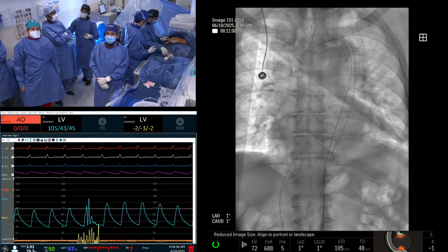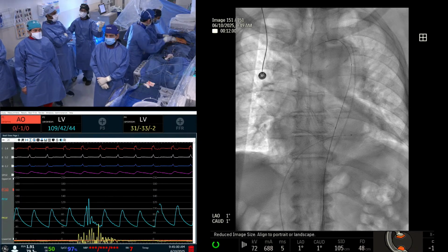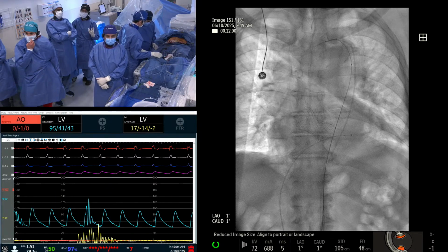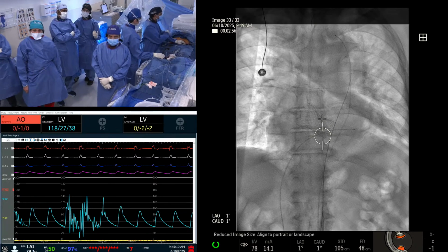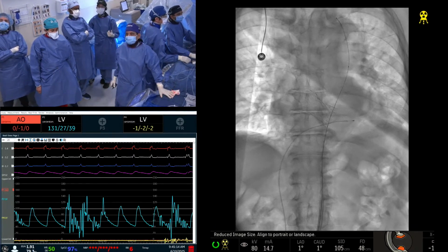If it's pure prosthetic AR or AS, like let's say this valve 5 years from now, 10 years from now, had failure because of stenosis or regurgitation, we would do in vivo sizing by CT. And we'll more likely use the 23 plus volume, because we've seen that if you oversize, you might actually have a risk of migration because of the mismatch.